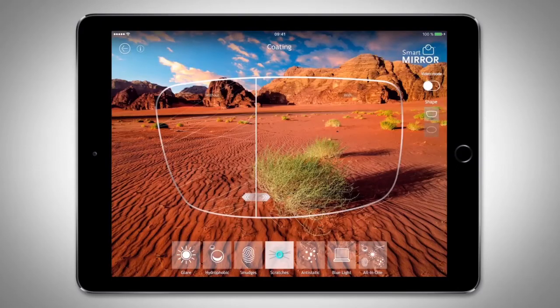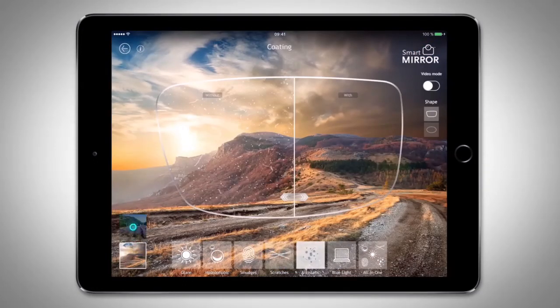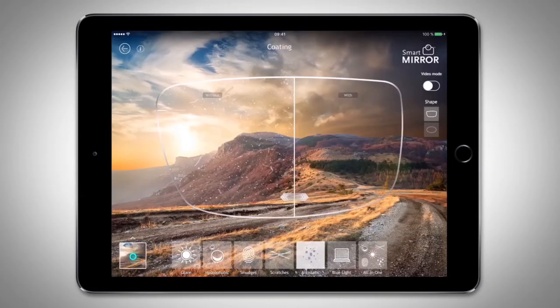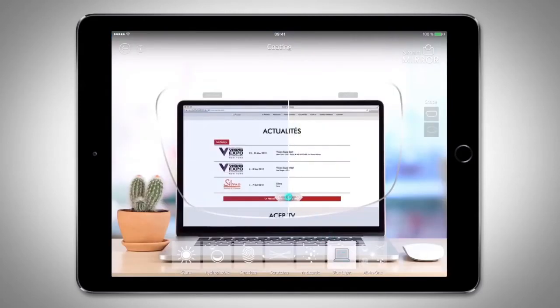Scratch-resistant coating has a much harder surface that is more resistant to scratching. An anti-scratch coating can lengthen the life of the lenses. You can use the augmented reality mode at any time. Premium anti-reflection treatments also help to repel dirt and dust. And today, the ability to add a blue-violet light inhibitor helps with the concern about electronic devices, especially when held very close to the eye.